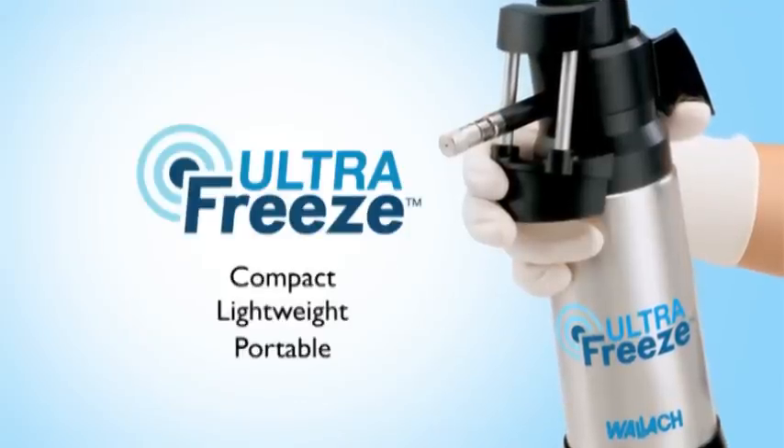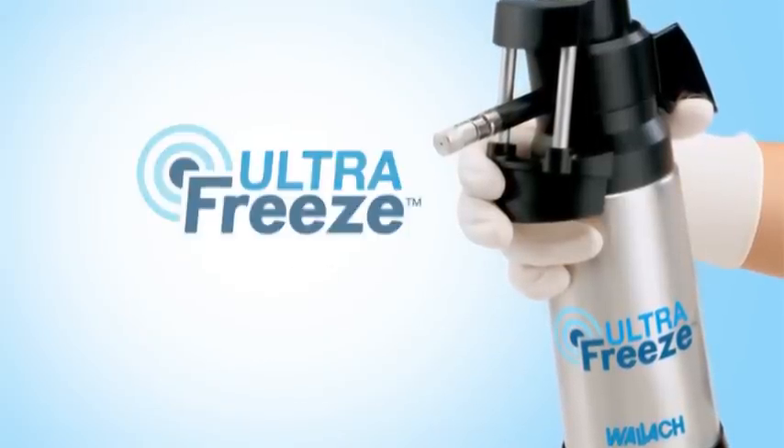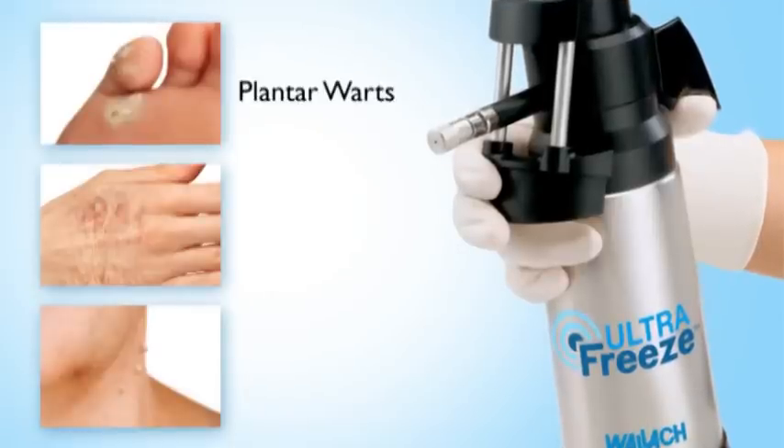Compact, lightweight, and portable, the system is designed for effective treatment of common skin disorders, including plantar warts, actinic keratosis, and skin tags.